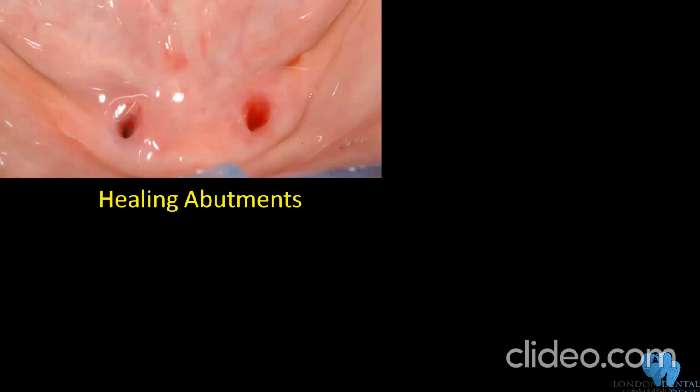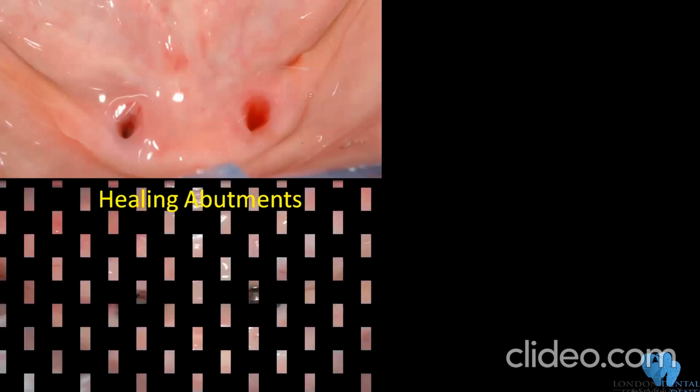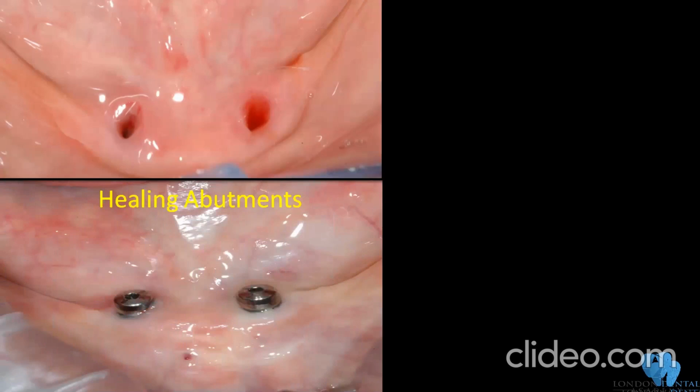If you don't have the locator abutments, what are you going to do? What other options do you have? Well, in these cases I normally tend to use different tools, different mechanisms, and my first go-to approach is to use two uni abutments, and then on these uni abutments I will go for a bar, for example. In this case, as you can see, the healing abutments, I think coming from the old Astra system, are probably 7 millimeters. Even with 5, 6 millimeter locator abutments might not be sufficient, because you need nice supragingival height.